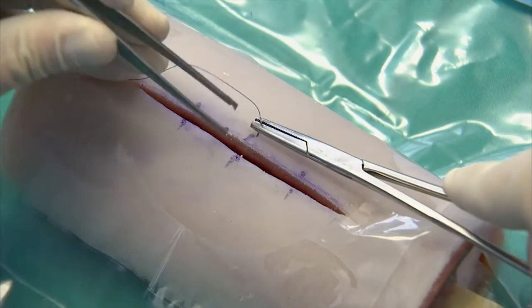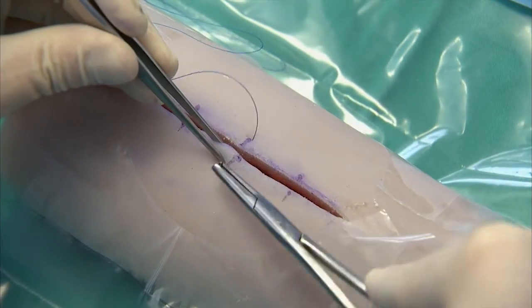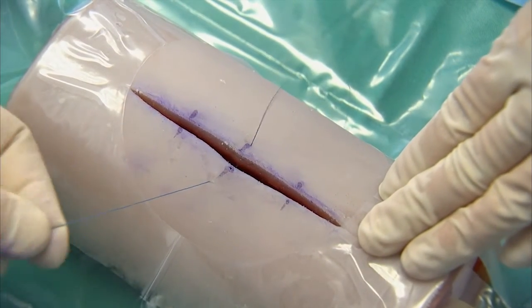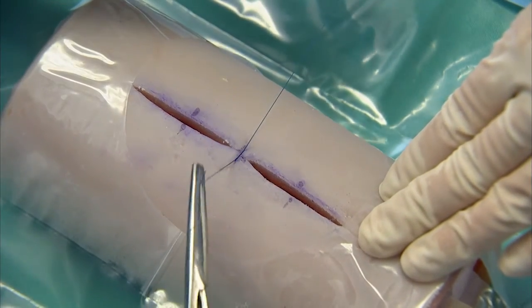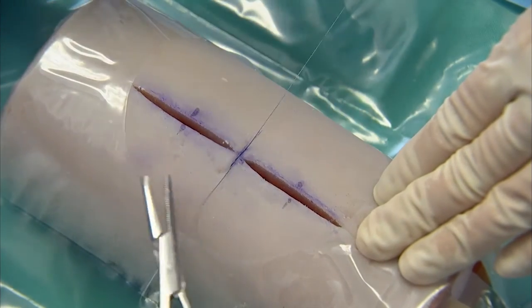Close the skin with non-absorbable sutures. Start closing the skin at the cross marks made before making the incision. This will facilitate closing the skin undistorted. Observe the meticulous placement of each individual interrupted suture. A nylon 3/0 suture will be used for the closure.